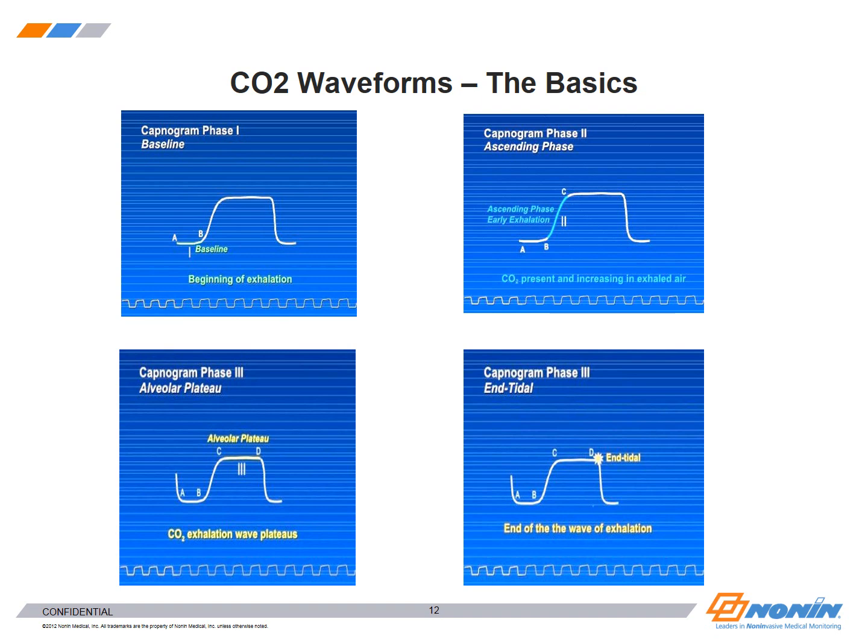The waveform, a lot of you have seen this classic square-shaped waveform where at the beginning of exhalation, they call it section A, section B. Then it moves out of early exhalation, or the ascending phase of early exhalation, so we're moving up to C, so up here. Then we plateau, so there's really an equilibrium here of gas, and this is where true measurement is occurring. And then when we get to the D phase, that really is your end exhalation, right there.